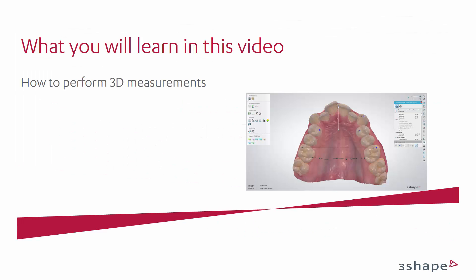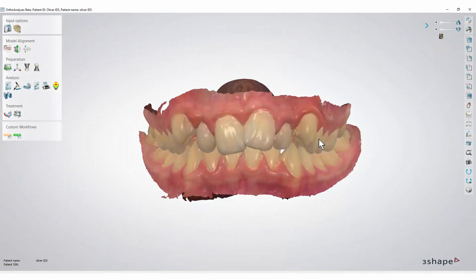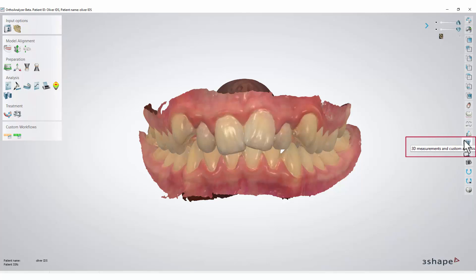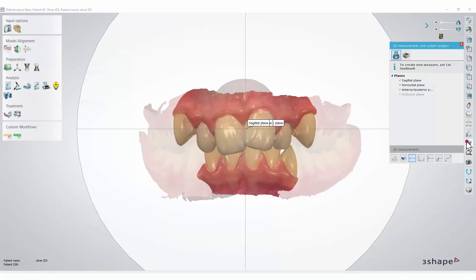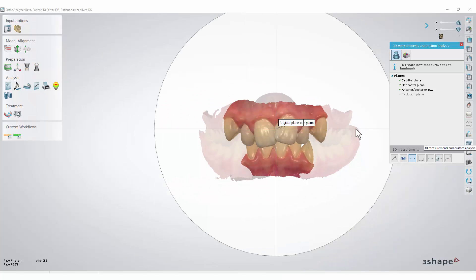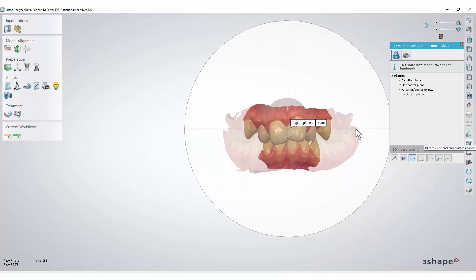In this video you will learn how to perform 3D measurements on a model set. To begin, go to the toolbar on the right side and select 3D measurements and custom analysis. You will notice that an additional window and standard planes appear automatically.